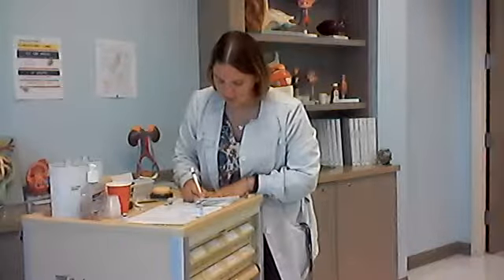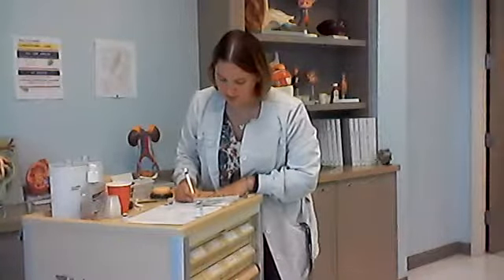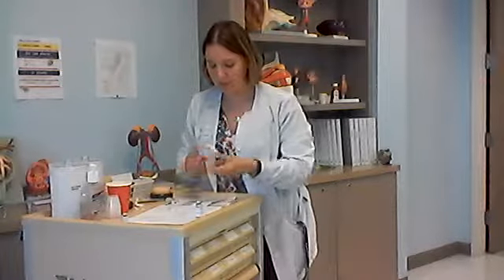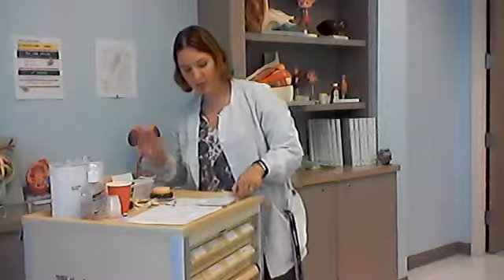I have hydralazine, 25 milligrams. IM. Time is now. And I will document at the end. Okay. So I'm going to label this, and then I'm going to put my vial away. This goes in the trash.